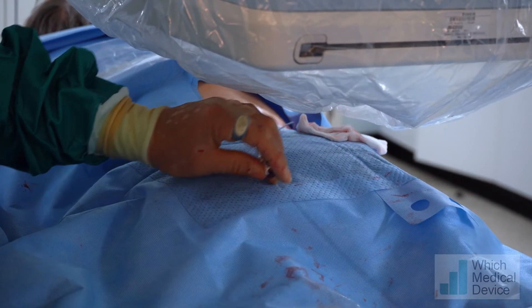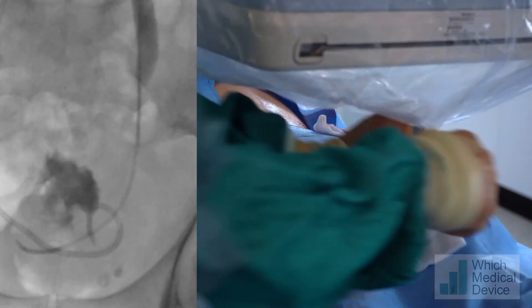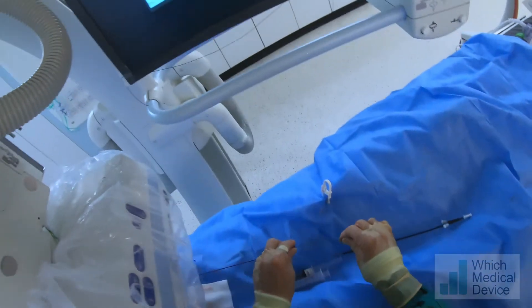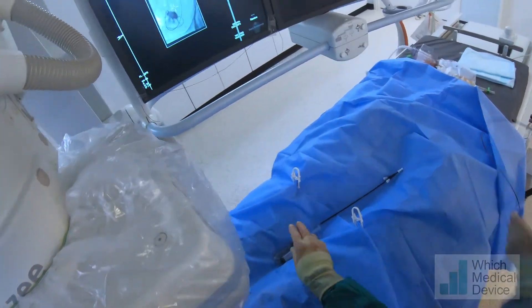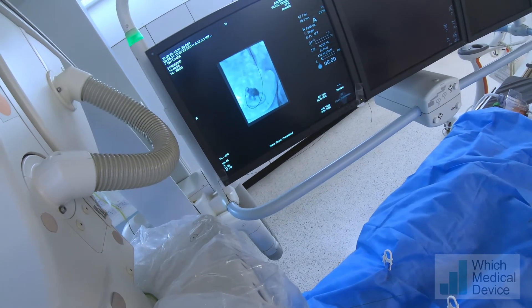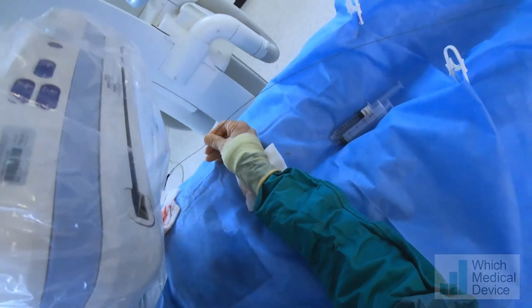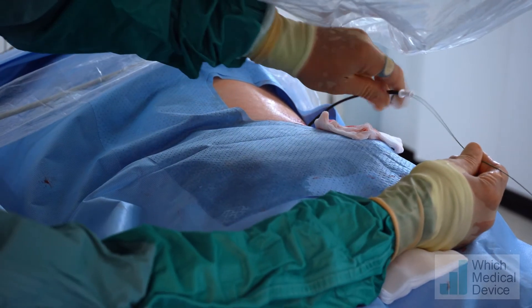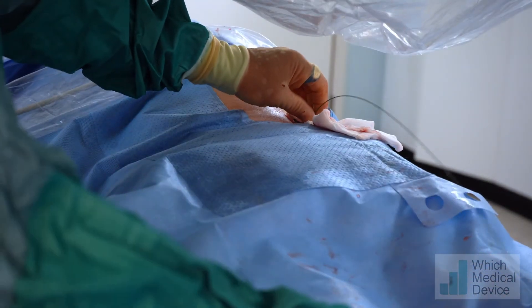We're now going to put in our extra stiff wire and put our 9-French peel-away sheath in. I'm keeping the wire tight and the wire has not withdrawn from the bladder as I've advanced the peel-away. We're going to let the system decompress through the peel-away sheath — put some gauze down to catch it — and then we'll pop the stent in.